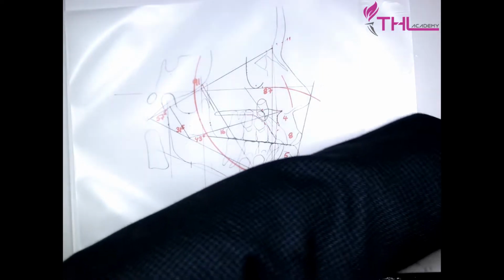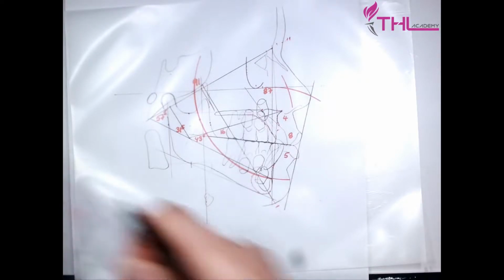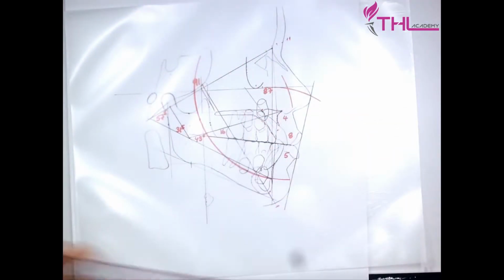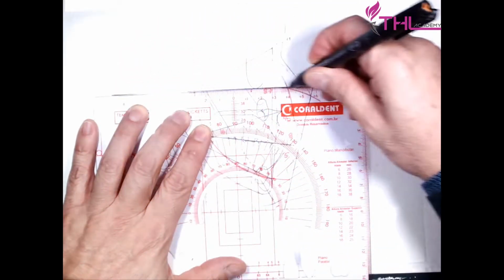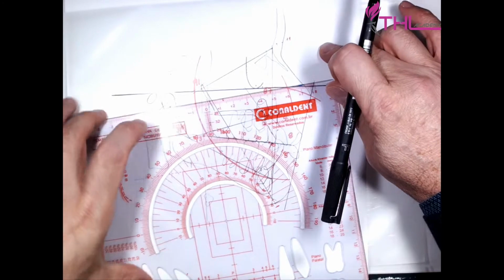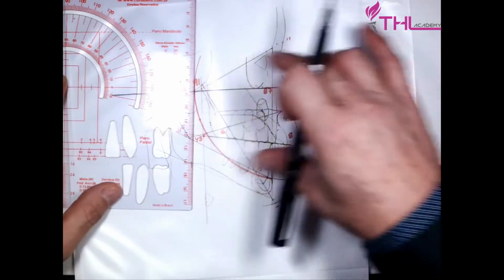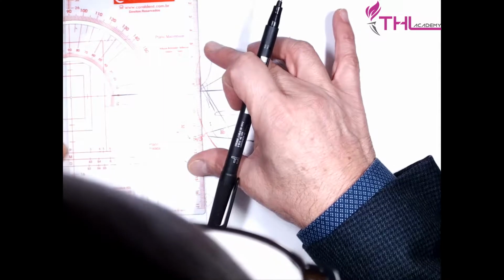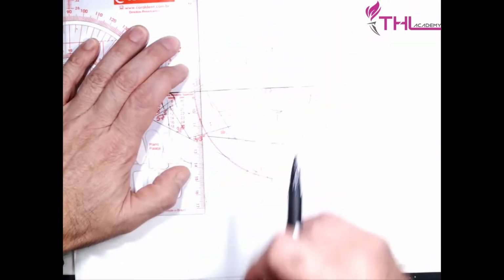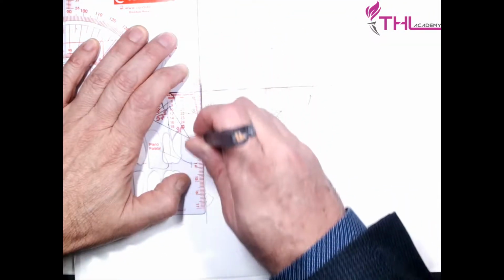The first thing I do always in my predictions, and this is not in your syllabus because it's not part of the technique, but I love to do, I always do a cross, okay, like this. So you can do this cross. This cross is very favorable. We have to remove some light. This cross is very nice as a coordinate reference.